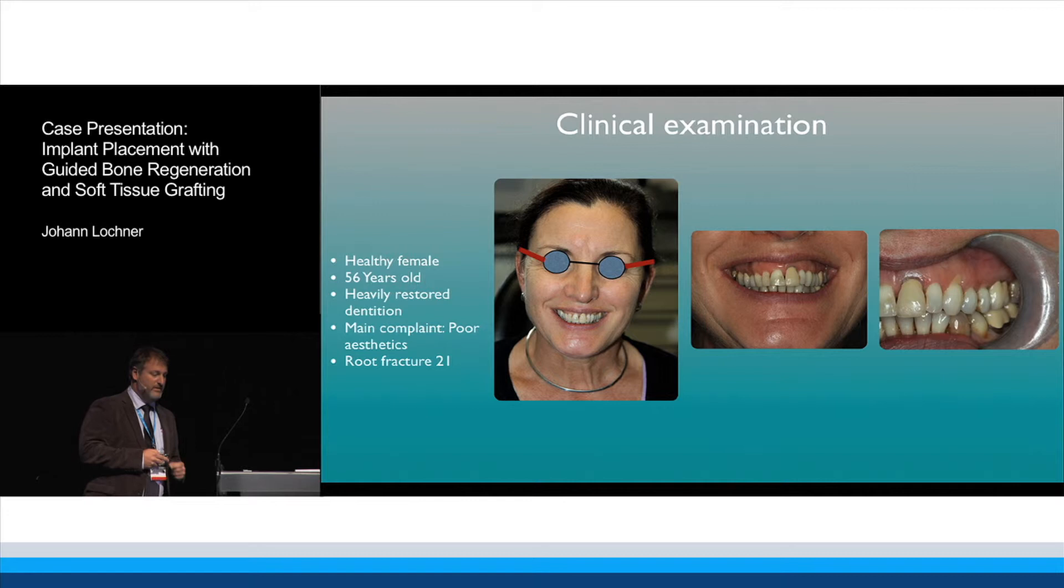There was a root fracture present on the 2-1, and if you applied pressure on the buccal surface, you could see that there was some pus draining from the area.